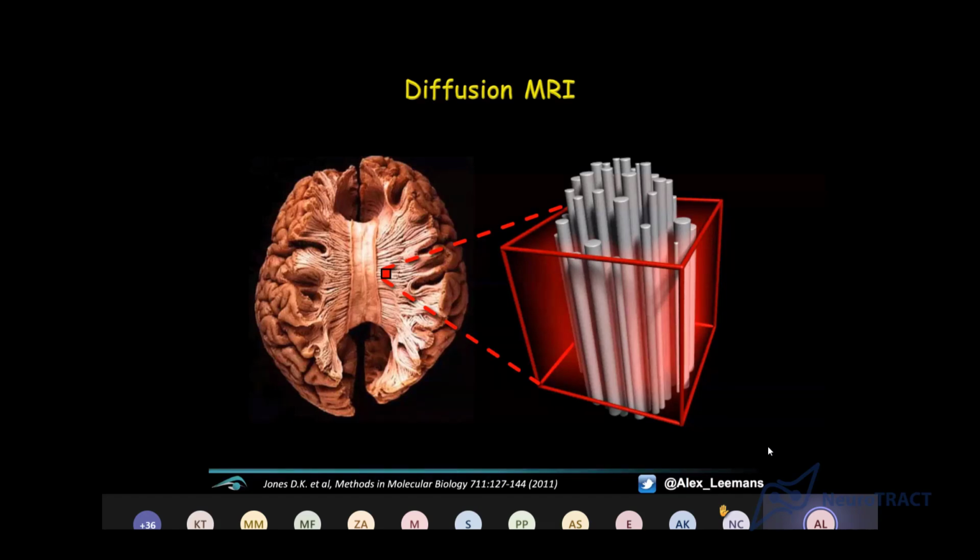It could be hindered, could be restricted diffusion, but there's clear architecture that guides the molecular motions, meaning that if we have water molecules, they will be hindered more perpendicular to the fiber structure than along the fiber structure because of cell membranes. Think of all these microstructural constituents of an axon, the filaments, the myelin sheets.